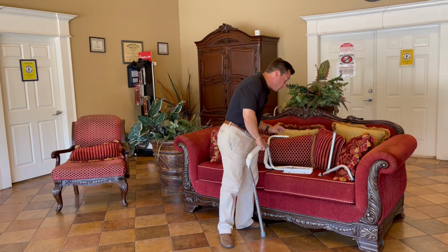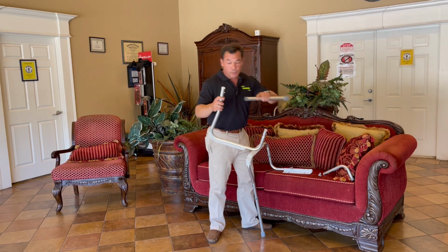And then we're going to repeat that with the other side, putting on the front leg.